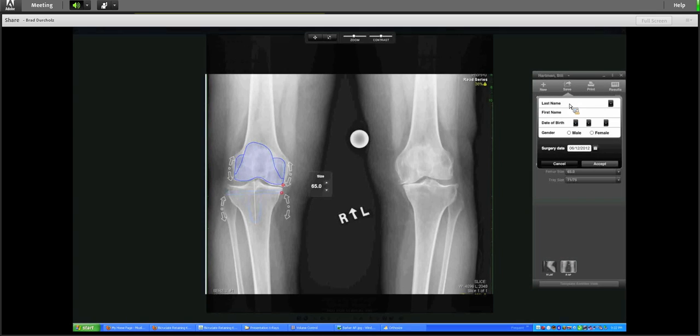I could type in the last name of the patient. So on this particular one, we'll just make up, well, let's do a name that I haven't chosen yet. Okay, so Tim Jerrison's in there. He's put in his birthday.